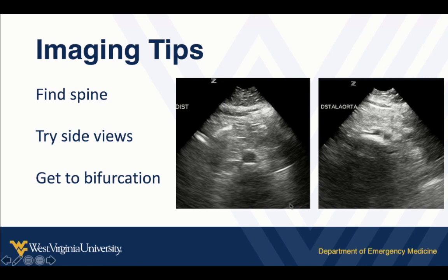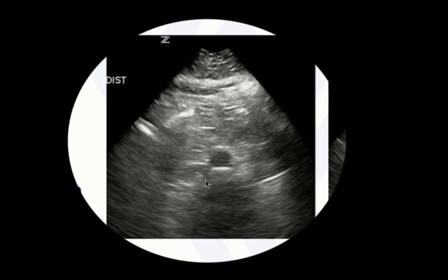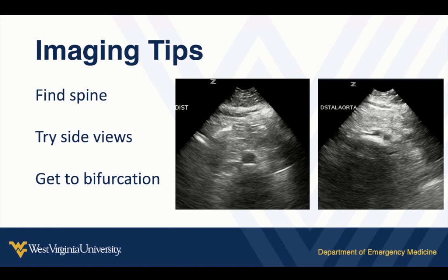A big tip when identifying the aorta is you've got to find the spine first. You should see this bright white arc with a shadow behind it. The aorta should sit on top of the spine. Sometimes you may have to come to the sides to get around bowel gas, especially because in the inpatient and emergency department world we often don't have fasting patients. Trace the aorta all the way down to the bifurcation and, if you can, see the first portions of the iliac arteries as well, because aneurysm there is less common but may occur.